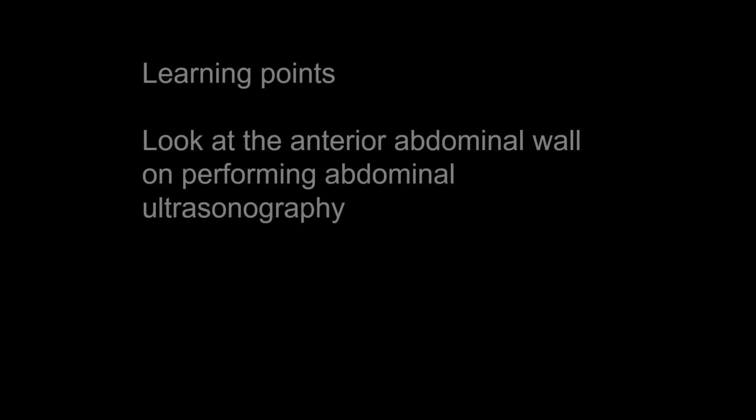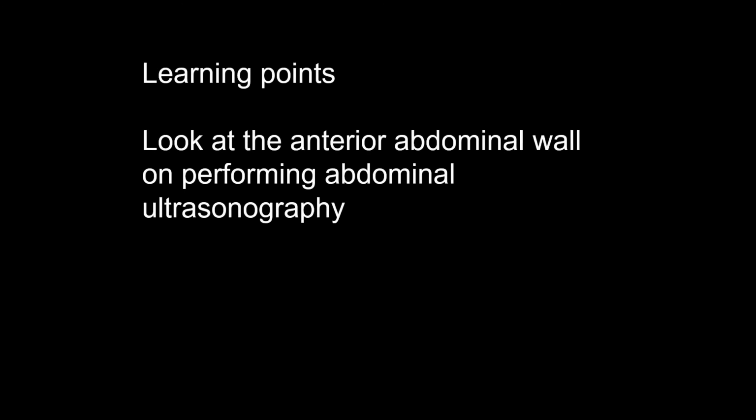So the diagnosis here is prune-belly syndrome. And we have learned to look at the anterior abdominal wall on performing abdominal ultrasonography, not just the internal organs.